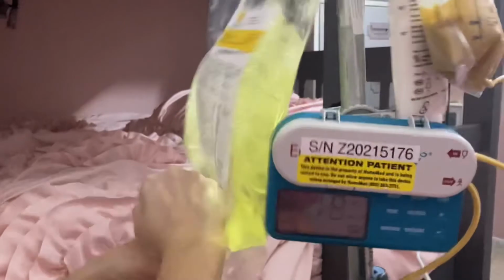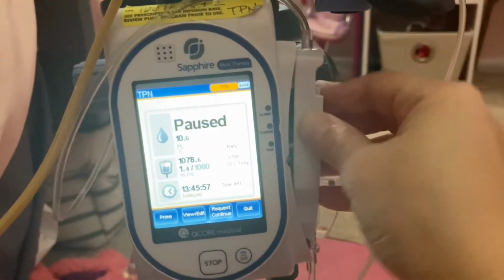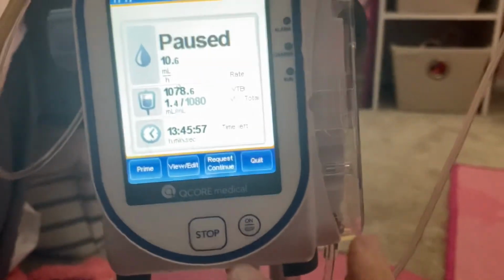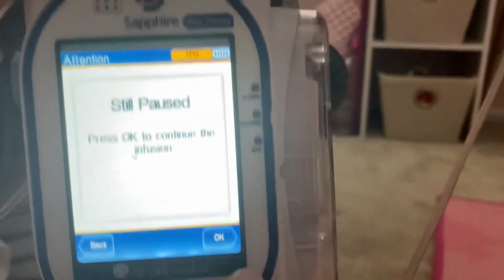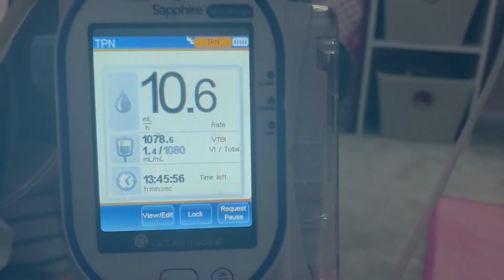Then we continue to flick up, and I hit the bag to try to get the air bubbles that might be caught where the bag is spiked. And as you can see, there's tiny little champagne bubbles, so hitting that helps them go up. Then when you think you are done, just pop the cassette back in and press request continue, OK, and it will start back up where it left off.